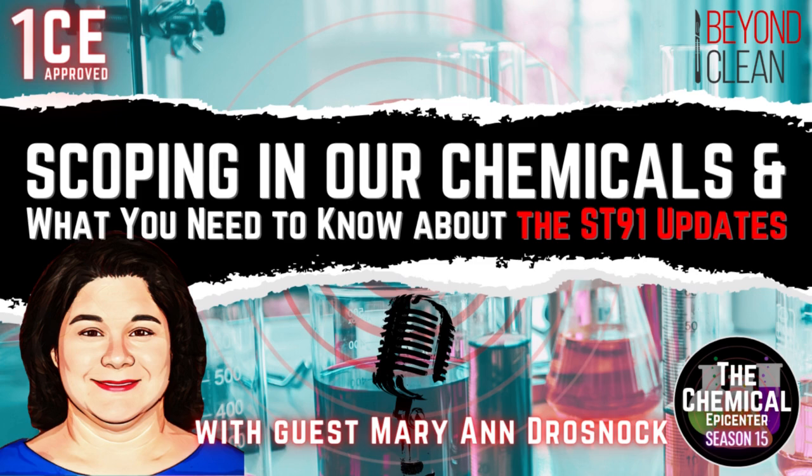I believe there'll always be a place for reusable scopes also in the market. So what we have to do is figure out what are we going to do with those scopes. And within that segment of the market then, like I said, we want to see things move as much as to sterilization as we can. Some of that might go for liquid chemical sterilization, but we still have those tough scopes where we don't have a lot of methods available now. So we're going to see high level disinfection hang on at least for a while for certain types of scopes. Again, maybe that's the duodenoscopes because they are a GI scope that's complex, but we know they have issues related to them. So what are we going to do to make that process better?